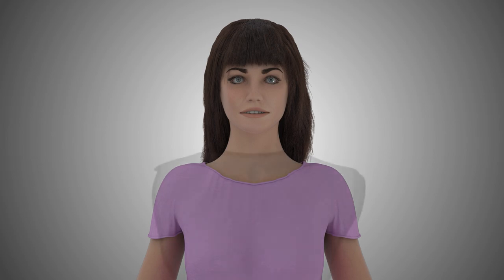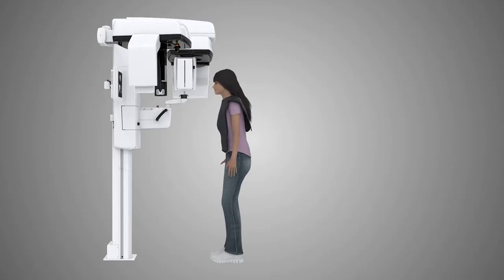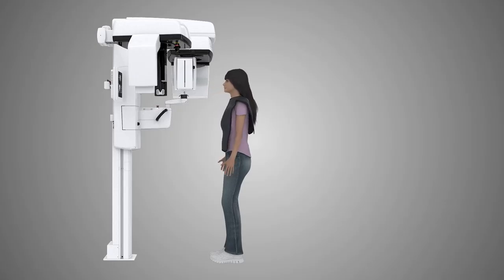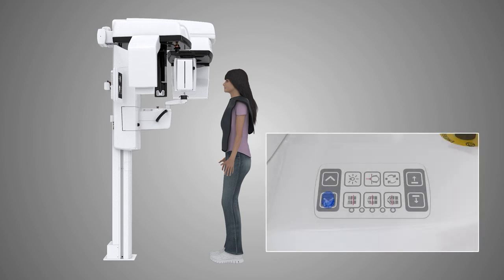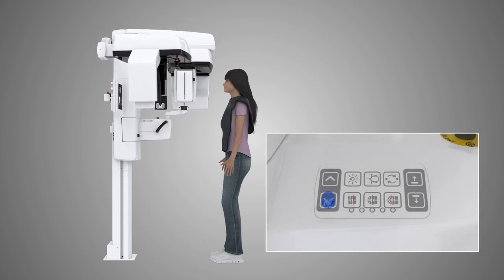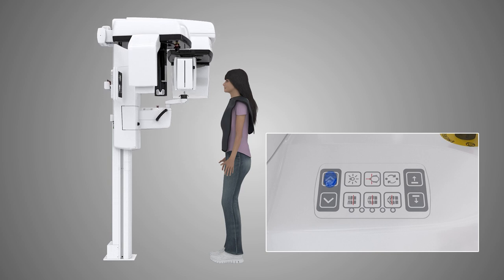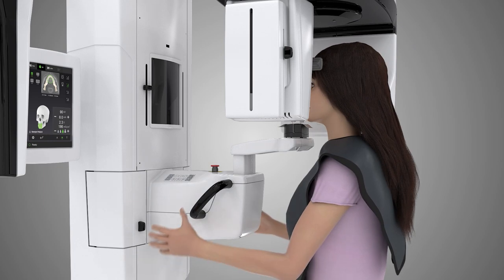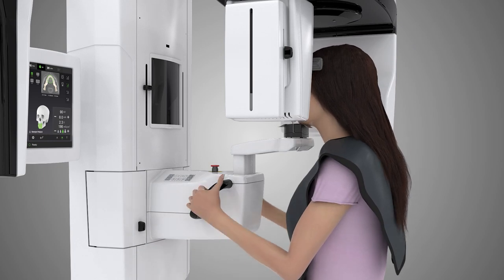Properly place a protective lead apron over the patient in accordance with local regulations. Instruct the patient to stand as straight and tall as possible in front of the unit for preliminary alignment. Adjust the unit's height using the up and down arrows on the positioning panel. Move the unit so that the chin rest is level with the patient's chin.